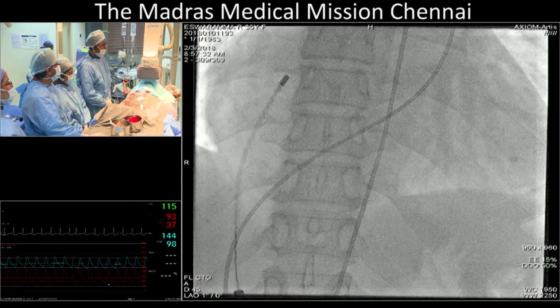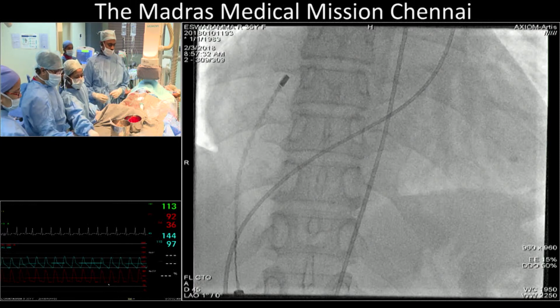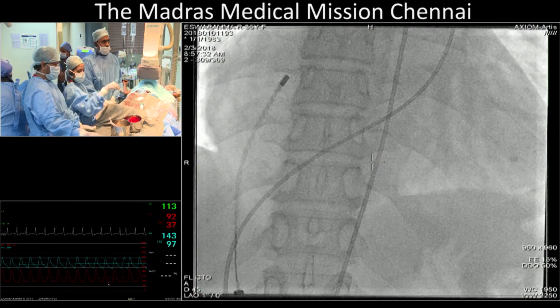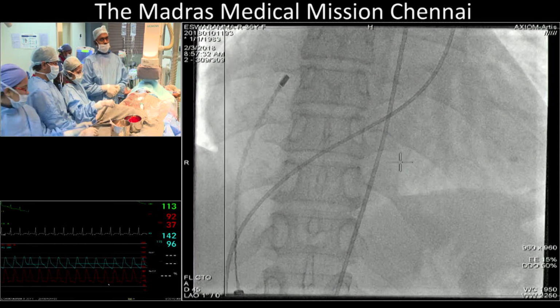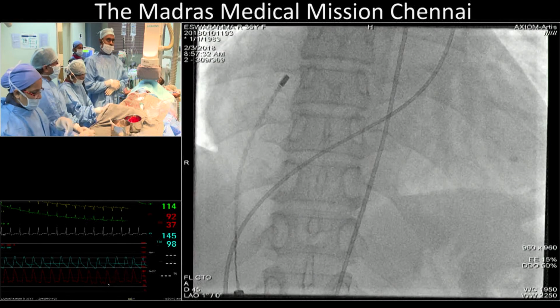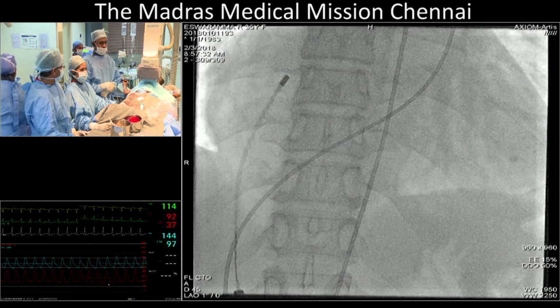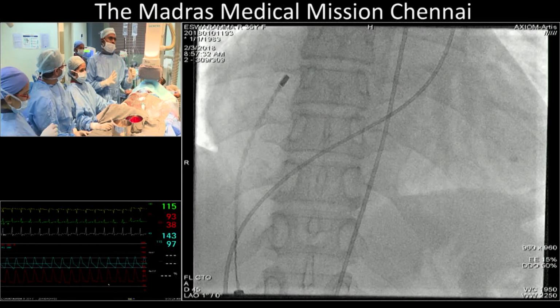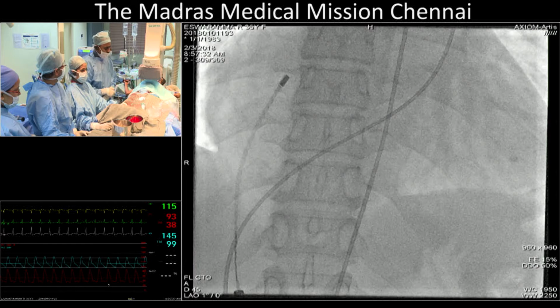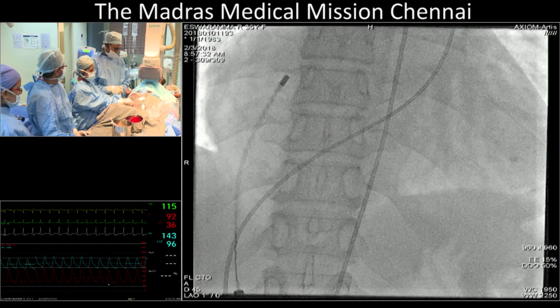Shiva, Tin is pushing us as well, so we need you to either make a decision or proceed. So what are you going to do? I see the pulmonary artery pressure at the end of 20 minutes of oxygen is not showing any reduction in the PA pressure. I agree that there is a 2.6:1 left-right shunt. The basal PVR index is close to 8 Wood units. I feel that this ASD should be closed with a fenestrated device, because you can always go back and, if you want to enlarge the fenestration, do it. You are right. Shiva, go for it. We know you're going to do what you're going to do, so that's okay.